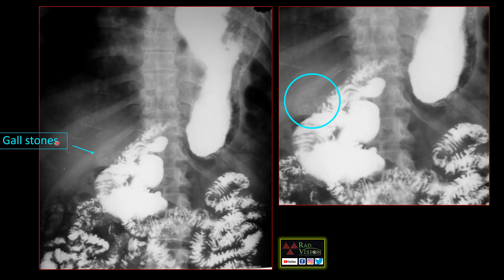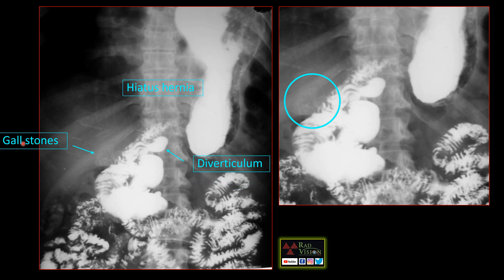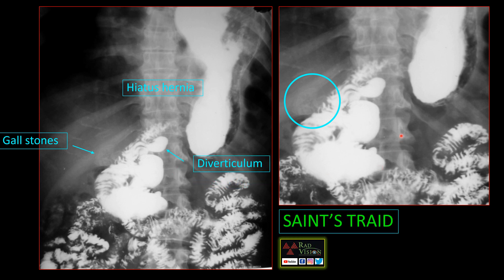If you are not able to see the gallstones, the diagnosis is different — you would write this as hiatus hernia with diverticulum. But whenever you see the gallstones, the whole diagnosis changes. So we have seen gallstones, hiatus hernia, and the diverticulum. When you club all three, the diagnosis is Saint's triad.